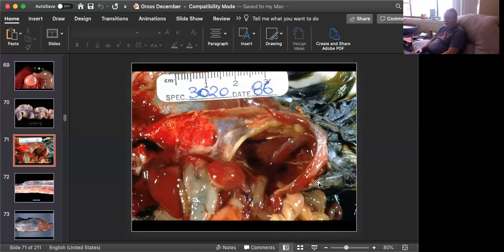And if you work a lot with psittacines, it used to be a problem in the turkey or poultry industry, but we hardly see it anymore. But you can still see the odd cases of human psittacosis in people that have lots of psittacines.